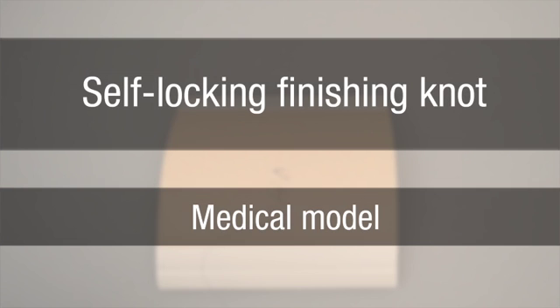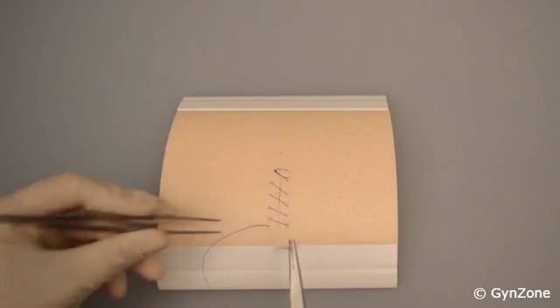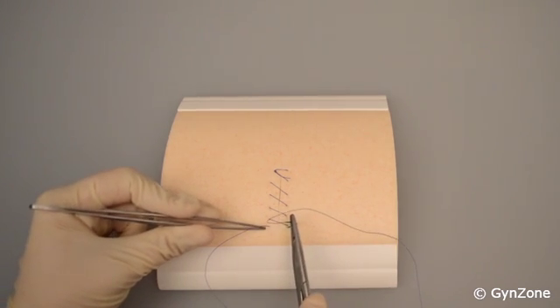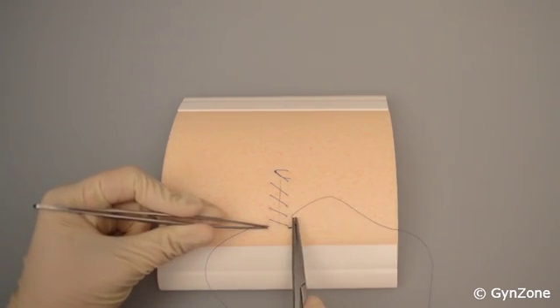This section demonstrates a self-locking finishing knot on a medical model using suture materials. Make one final straight stitch on your continuous suture at a relatively close distance to the previous stitch.